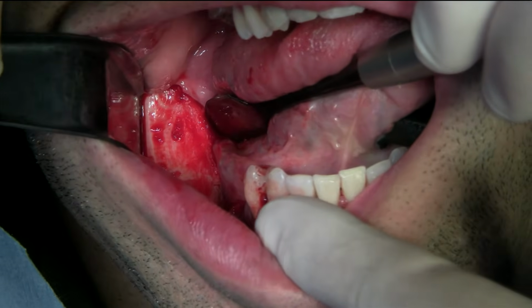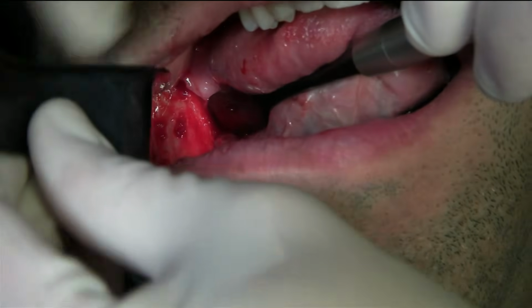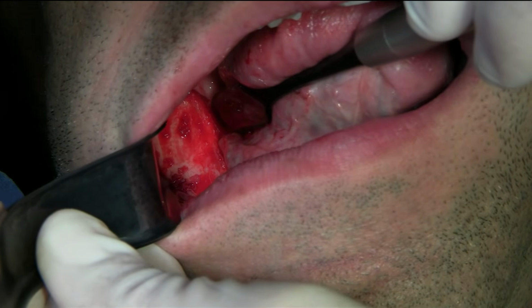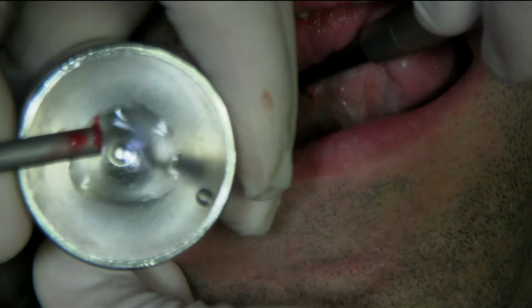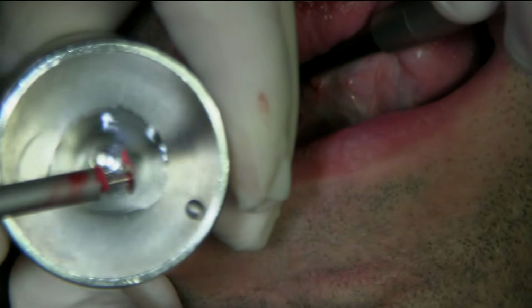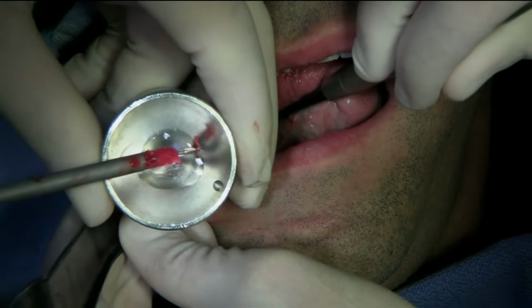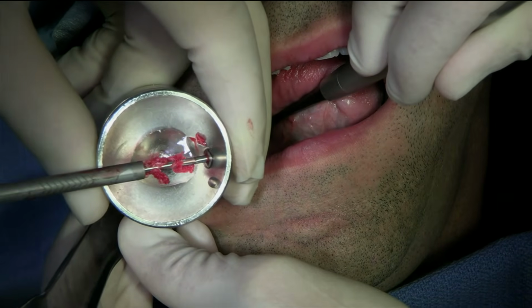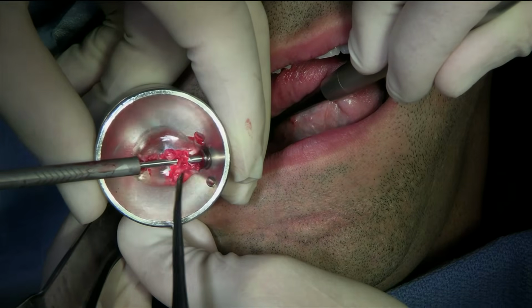Okay, so now let me show you the amount of bone we have here. Some irrigation. There's some bone there too. So that's really the amount of bone we've collected initially.